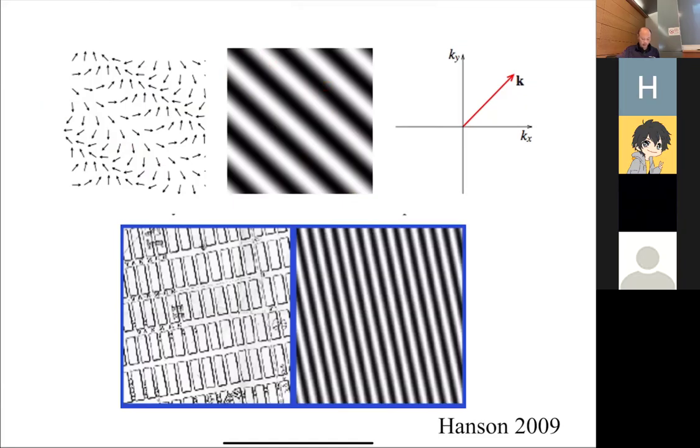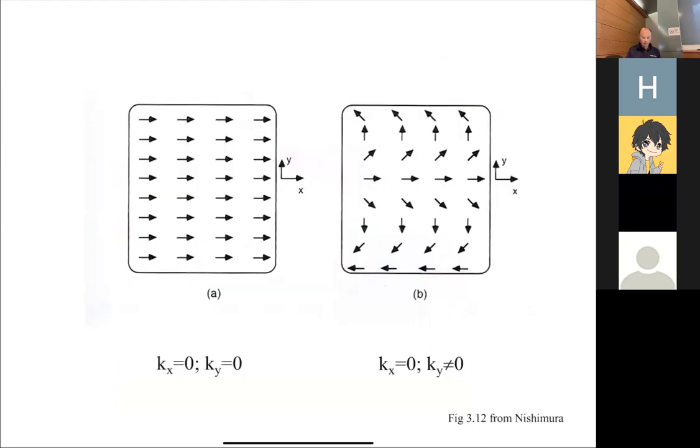And it's just showing, I think this is from this article that's in the module, just showing that because there's a lot of edges and things in our natural world, especially the human world, Fourier transform is still very useful. Obviously, there are other transforms like wavelet transform, but Fourier transform is very useful.